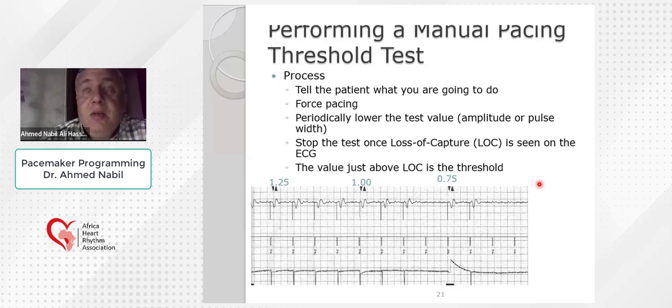I will tell him that you will feel now some rapid rates. Don't be worried. Don't be anxious. I am doing this procedure. I am doing this high rate. Don't be worried. Then I will start the forced pacing and periodically lower the test value, which is the amplitude.